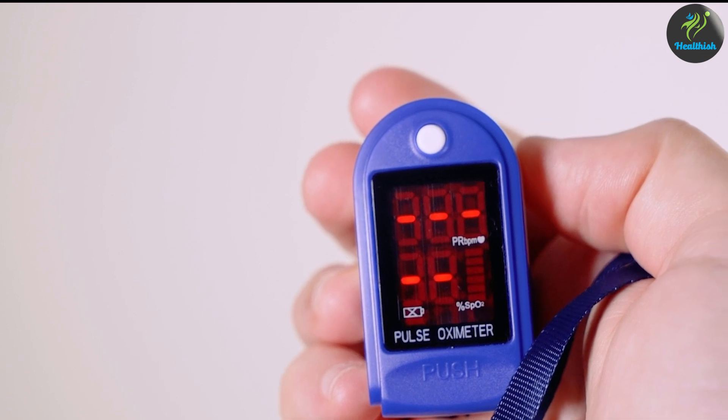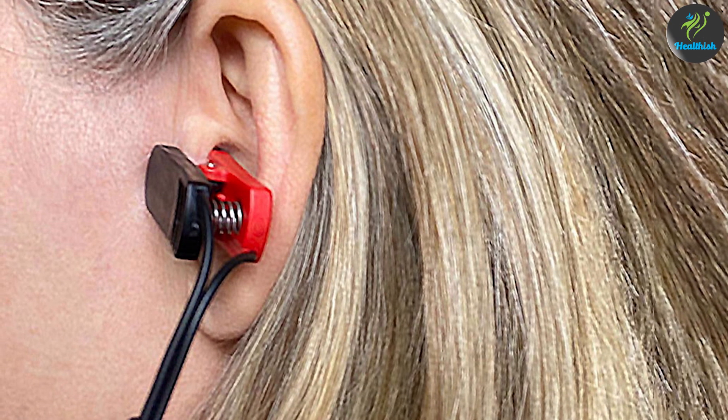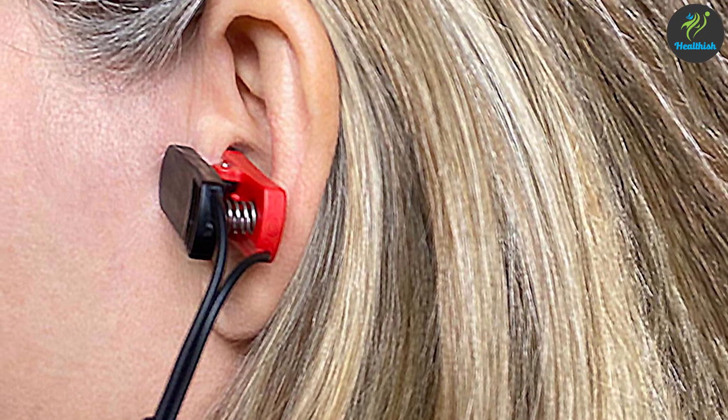Accuracy is a crucial factor when it comes to pulse oximeters. Both ear and finger pulse oximeters are generally accurate in measuring blood oxygen saturation levels and pulse rate. However, it's important to ensure proper positioning and a stable signal for accurate readings with either type.